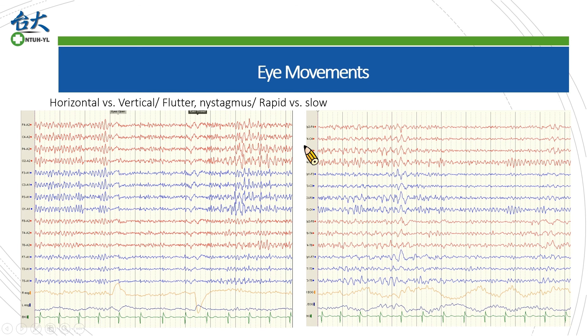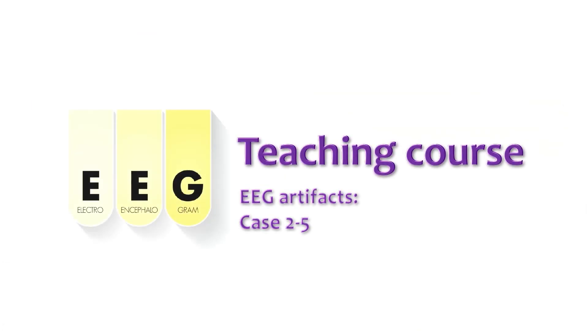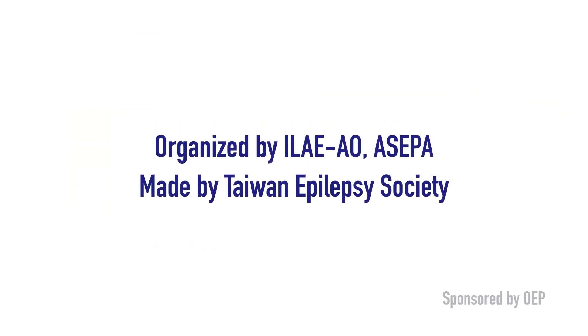Eye movements also have different types. A coronal montage can eliminate vertical eye movement but not horizontal. Very rapid eye movement may be observed in eye flutter or nystagmus. The latter may have different shapes in rising and falling phases, corresponding to the fast and slow phases of nystagmus. Sleep medicine specialists may also be familiar with differentiating rapid and slow eye movement, which indicate different stages of sleep.